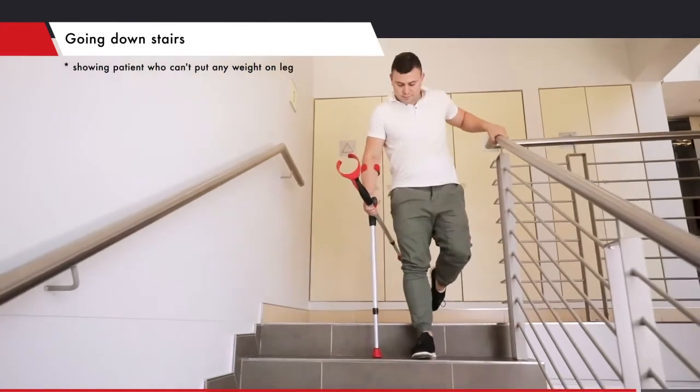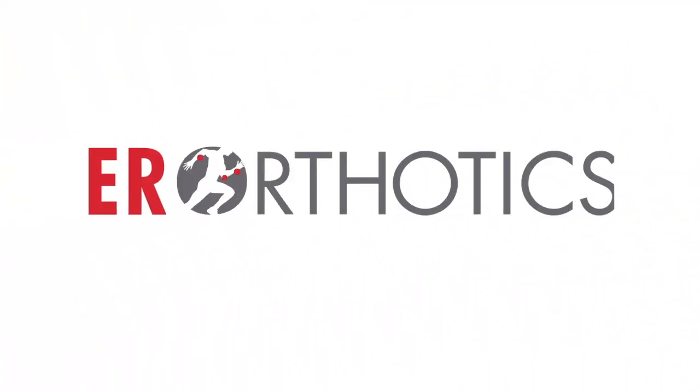Hold on to the handrail, lower the crutch to the step below, then step down with the strong leg.